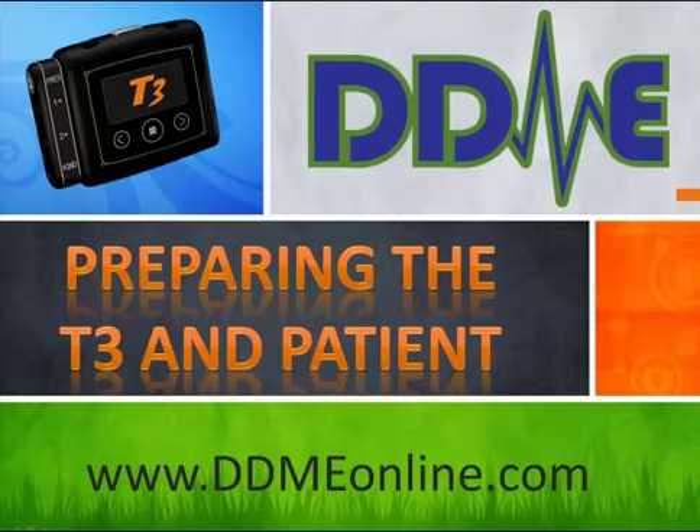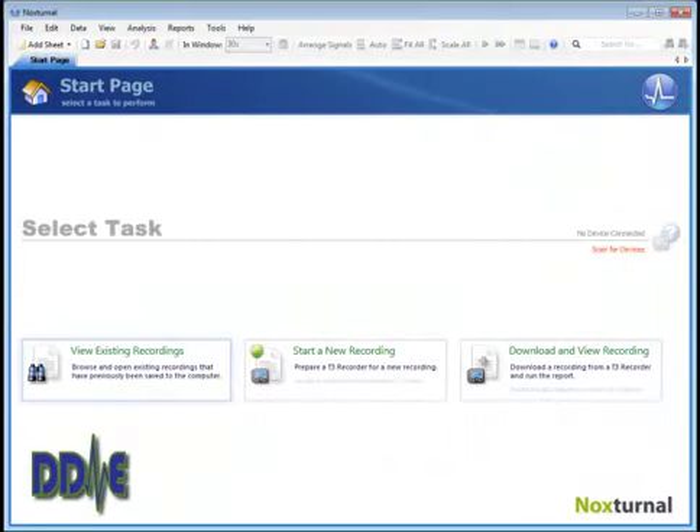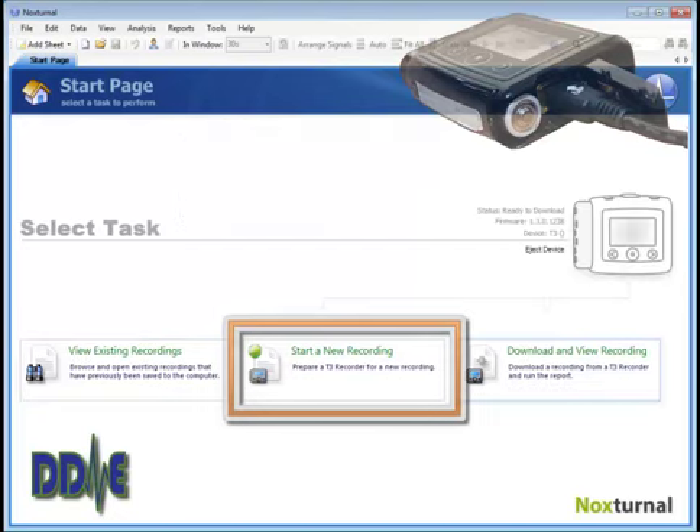Preparing the T3 and your patient for a home sleep study. The first step is to open the battery door and plug a USB cable into the T3, and you'll see an image of the T3 show up in the software.